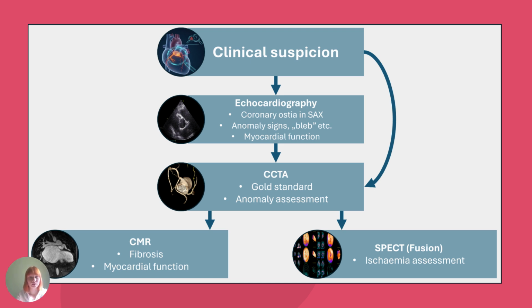I will go back, and then with this kind of suspicion, the patient can be referred straight to the gold standard CCTA if the suspicion is strong, or can be directed to echocardiography as it is easily performed in most places.